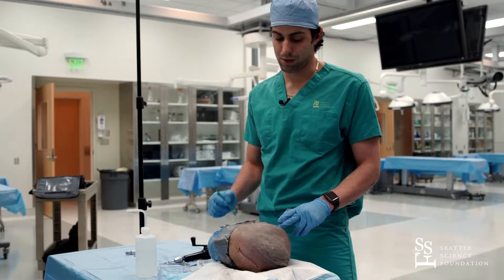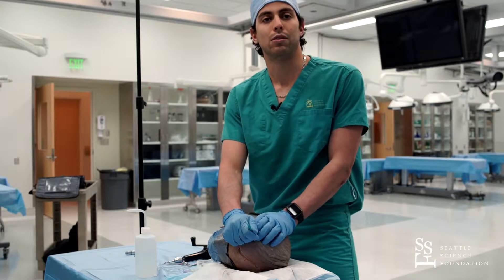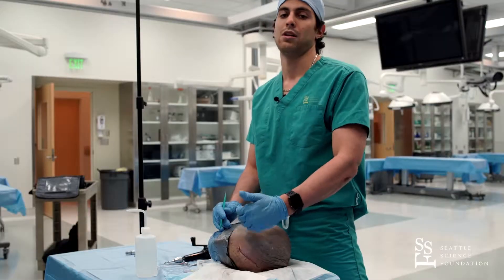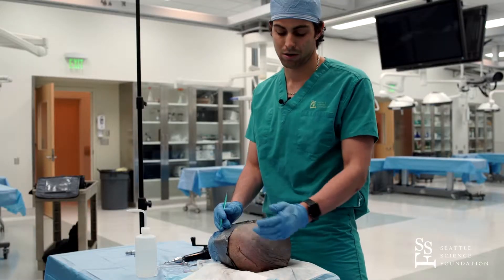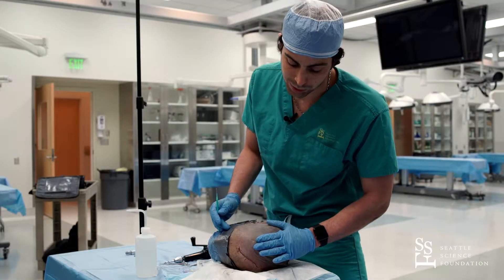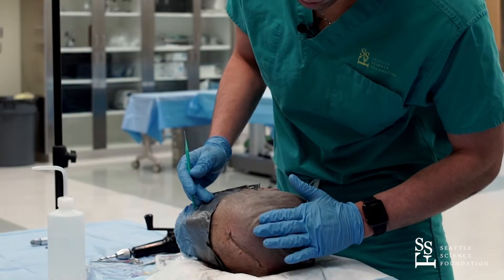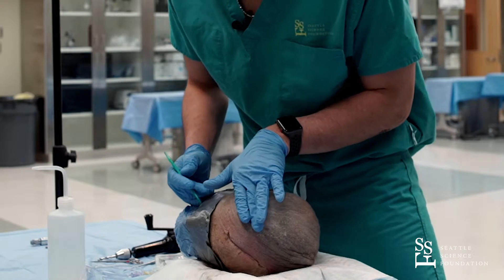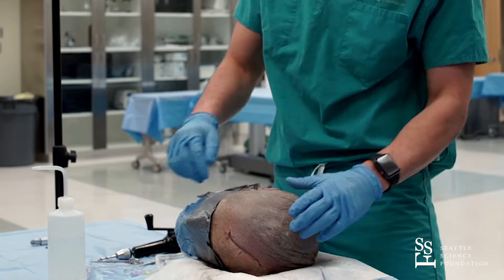The next one will be frontal. You just need to remember to stay away from the midline and place it right anterior to the coronal suture. The measurement will be around two fingerbreadths lateral and two fingerbreadths anterior to the coronal suture.